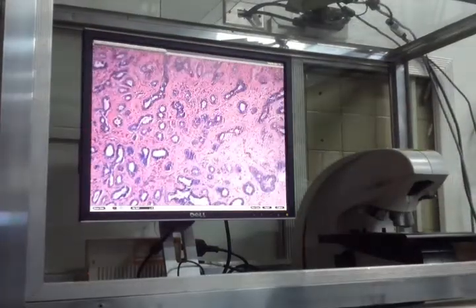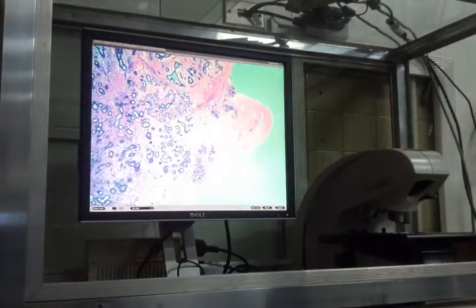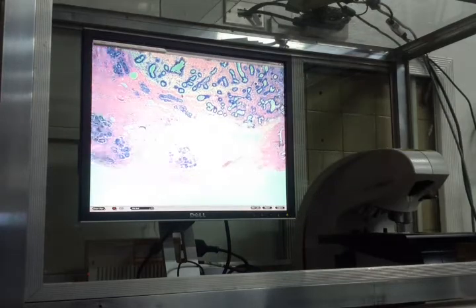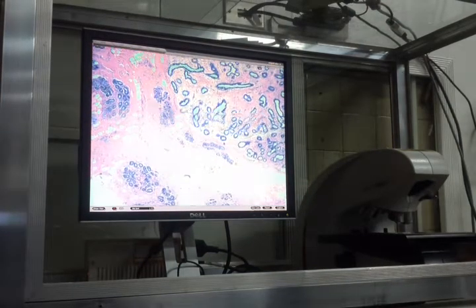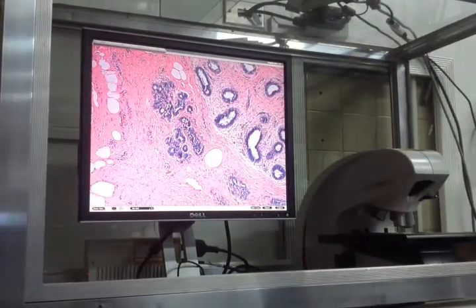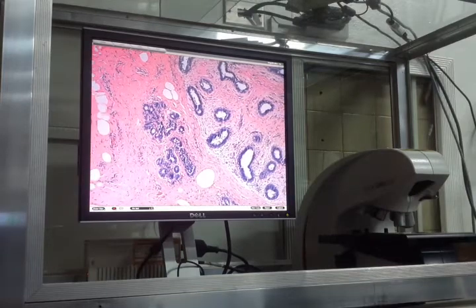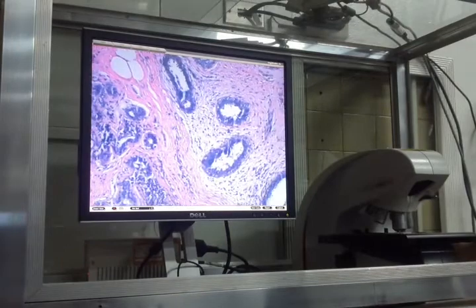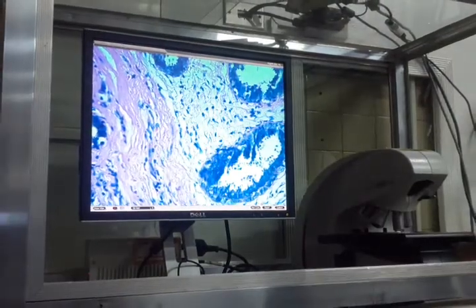Okay. The same ductules you saw in your histology in the resting mammary gland, pareho. Higher magnification will show you that you have ductules lined by epithelial cells sa loob, tapos sa baba may myoepithelial cells ka. Ito yung layer ng myoepithelial cells. Okay?